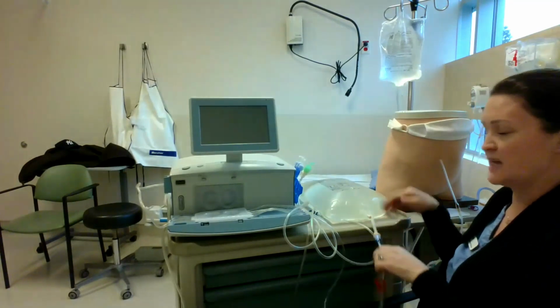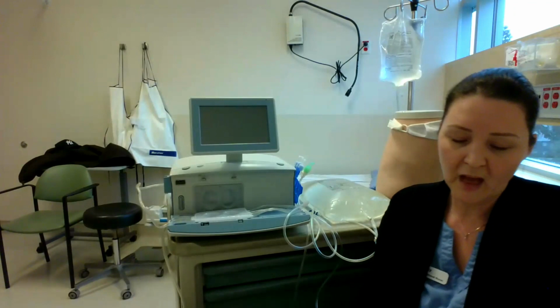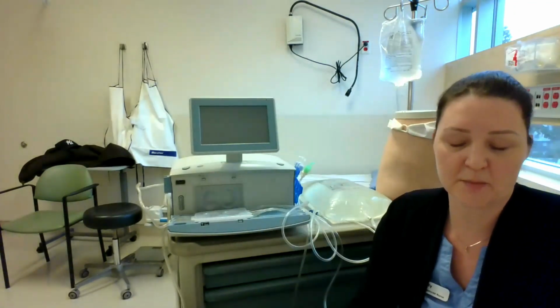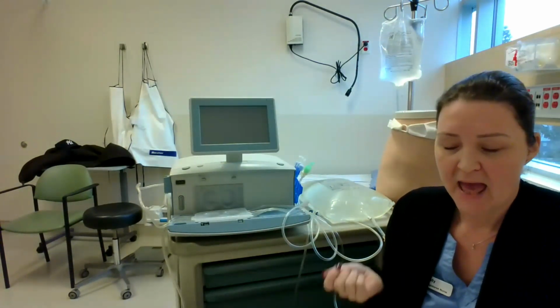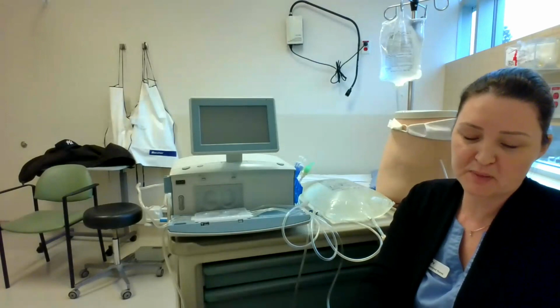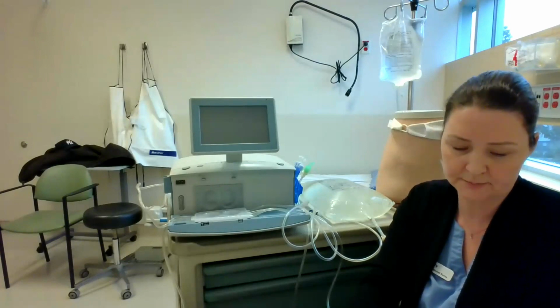Gets connected like this. And usually there are 3 bags total. This cycler machine, once you turn it on, it'll tell you a step-by-step process on how to set it up. The cycler is usually used at night, and it's usually about 8 hours. The machine automatically performs patient therapy by filling and draining dialysate throughout the night.